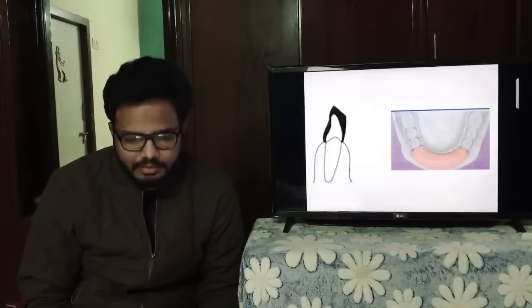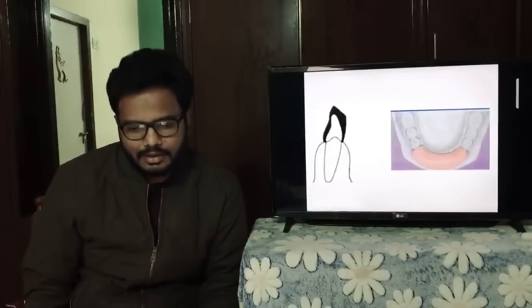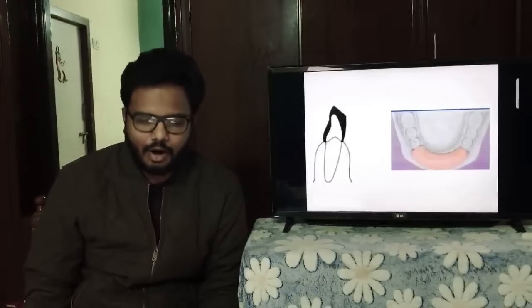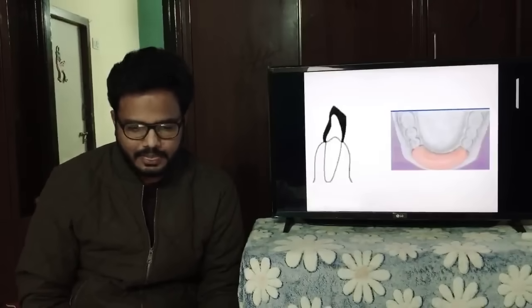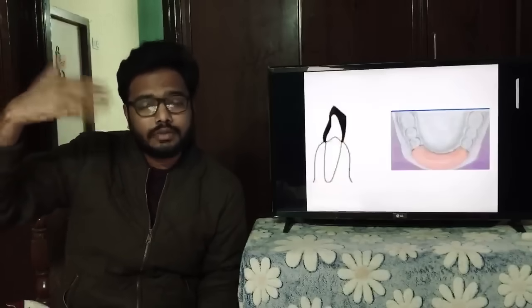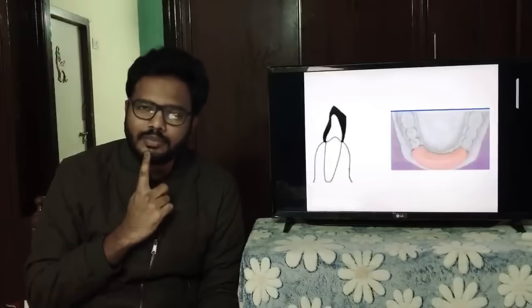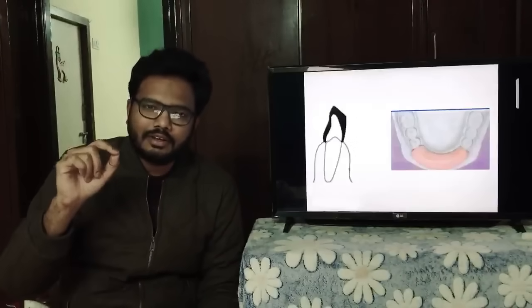Yes, it's an anterior bite plane. To be more accurate, lower anterior bite plane or inclined plane, or it's also called the Catalan appliance. Wonderful. Catalan appliance. As you can see, we have a 45 degree slope which enables the maxillary teeth, which are, if at all, lingually or palatally placed, to come more into labial position. So for correcting anterior crossbites, Catalan appliance, right?